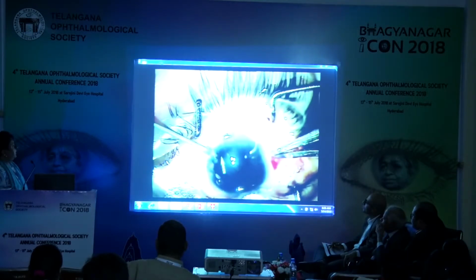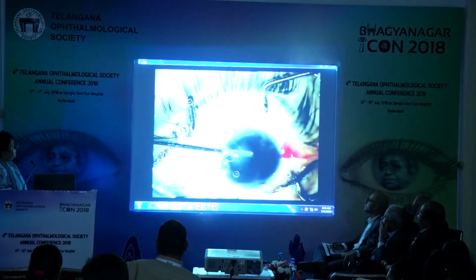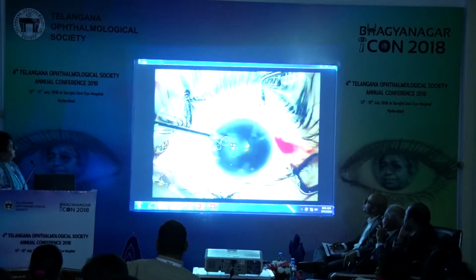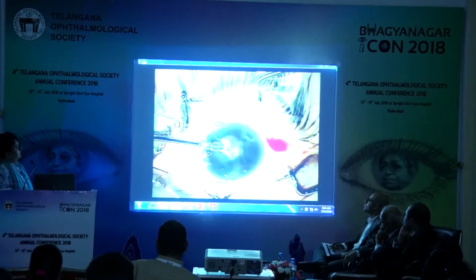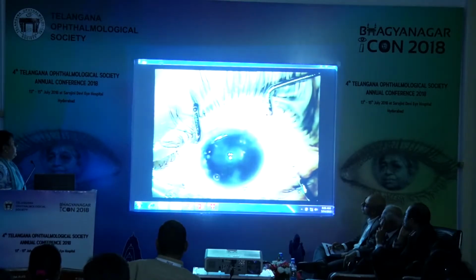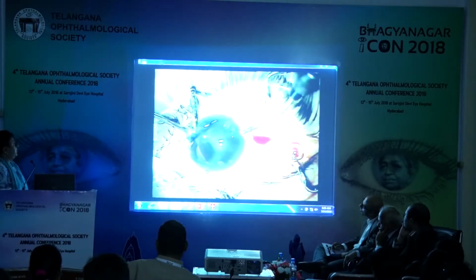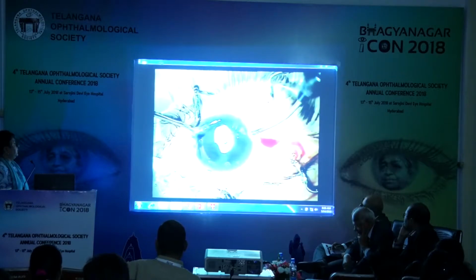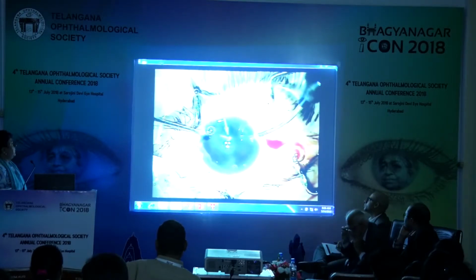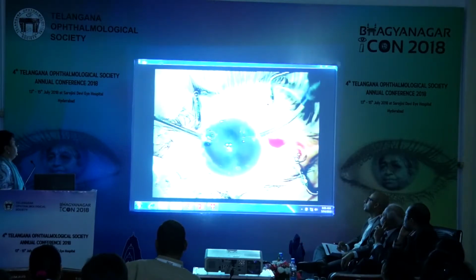A corneal incision was made overlying the pre-existing peripheral iridotomy at 10 o'clock, and a 20-gauge vitrector was used to cut the pigmented pupillary membrane. A second paracentesis was then made at the 3 o'clock position, and the vitrector was introduced almost vertically, initially facing the surgeon to enlarge the iridectomy and perform a zonulectomy. Following this, the vitrector is slowly rotated to face anteriorly whilst performing a hyaloidectomy.